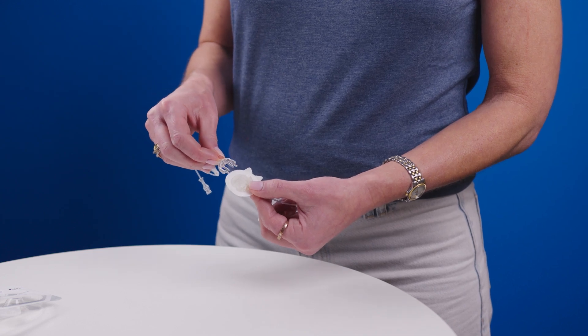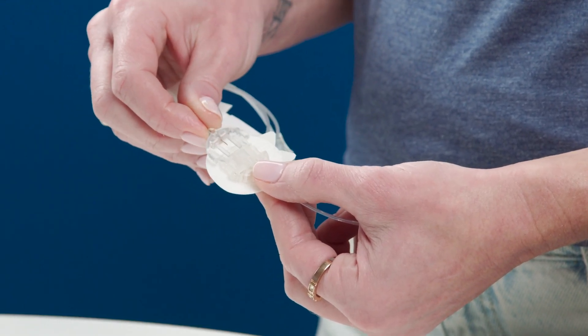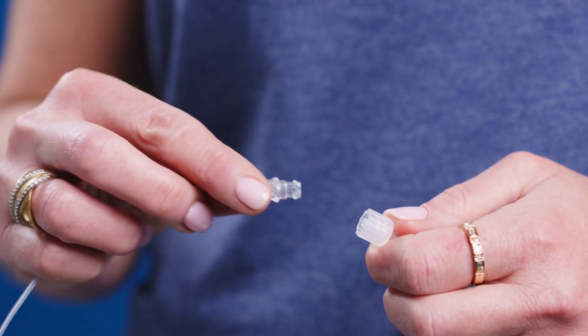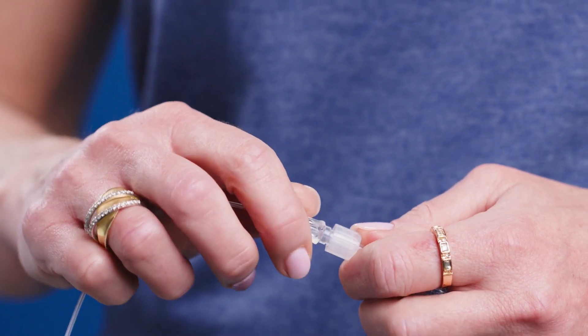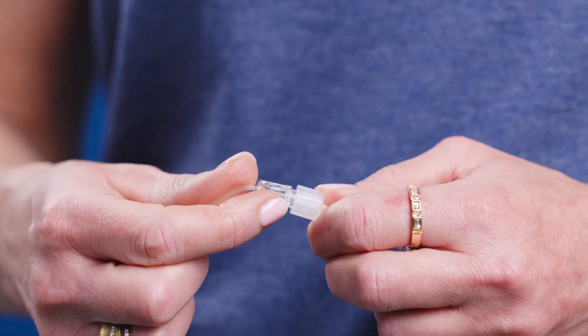Now, connect the two tubing pieces together so you have one continuous line. If they're not clicking into place, flip one end over and try again. Attach the tubing to the cartridge connector and twist clockwise until it's tight. A small space is normal.